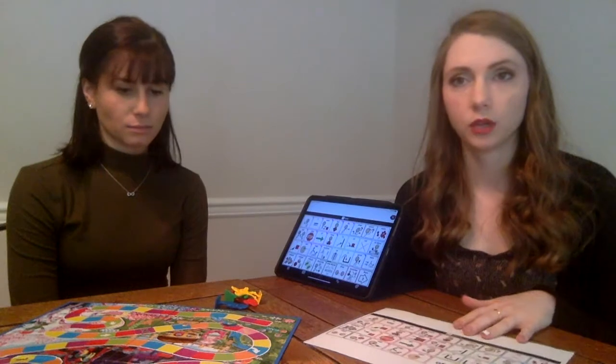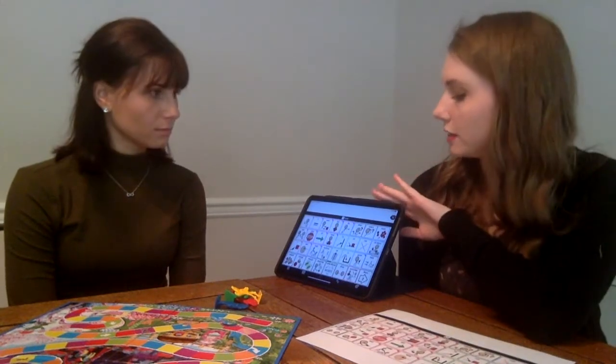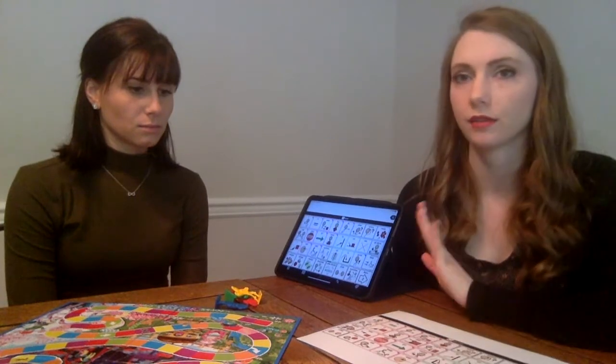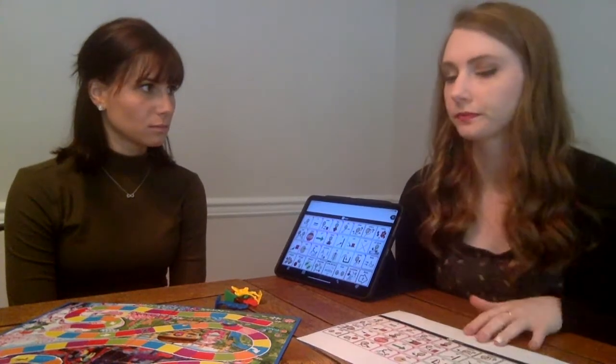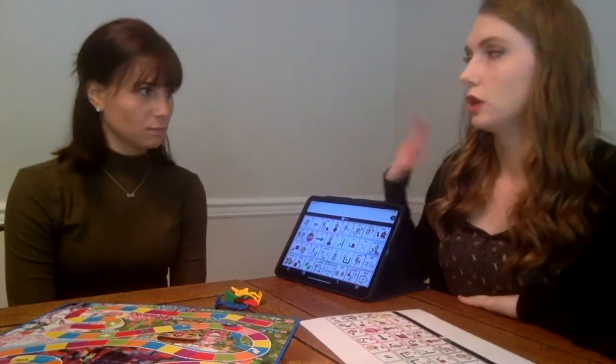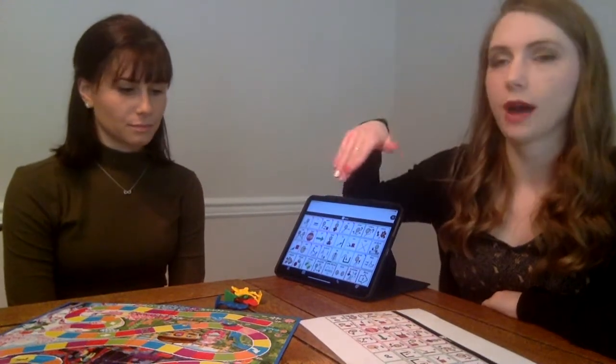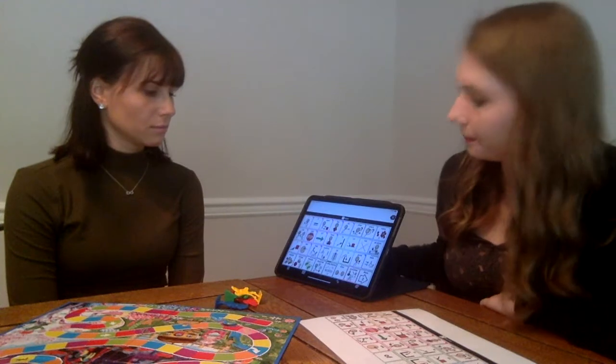All I did for this communication board was screenshot the first page and then print it out so that I have my own copy and don't have to touch the child's voice. So I'll show you. Alyssa's going to be the child, I'm going to be the adult, and we will model some of these things for you.